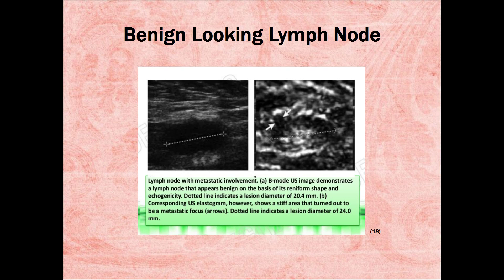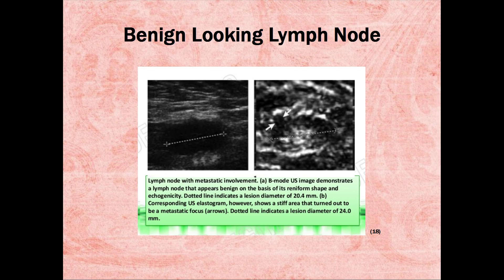Note the intranodal cystic necrosis, which appears as an echolucent area within the lymph node shown in arrows. Don't take for granted that if it looks benign, it is, because sometimes that is not the case. Here is a case of a lymph node with metastatic involvement. B-mode ultrasound image demonstrates a lymph node that appears benign on the basis of its reniform shape and echogenicity, with a lesion diameter of 20.4 millimeters. However, the corresponding ultrasound elastogram shows a stiff area that turned out to be a metastatic focus, with a lesion diameter of 24 millimeters.